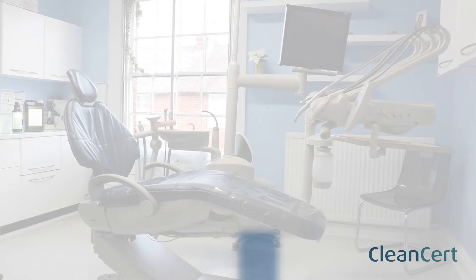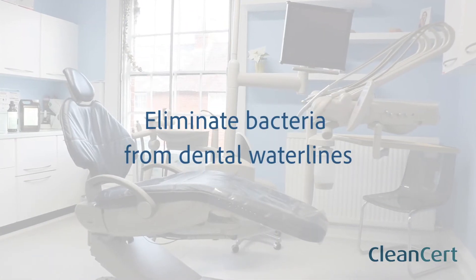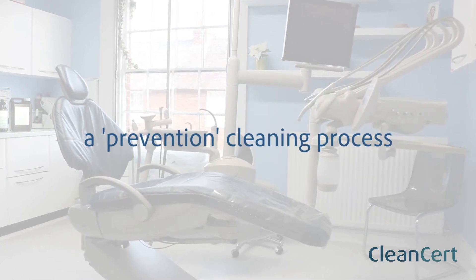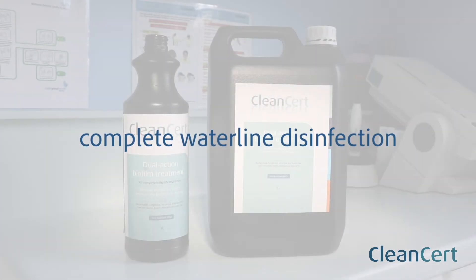This video shows you how to continuously eliminate bacteria from inside your dental water lines and is therefore called a prevention cleaning process. It is one of two methods recommended for complete water line disinfection.